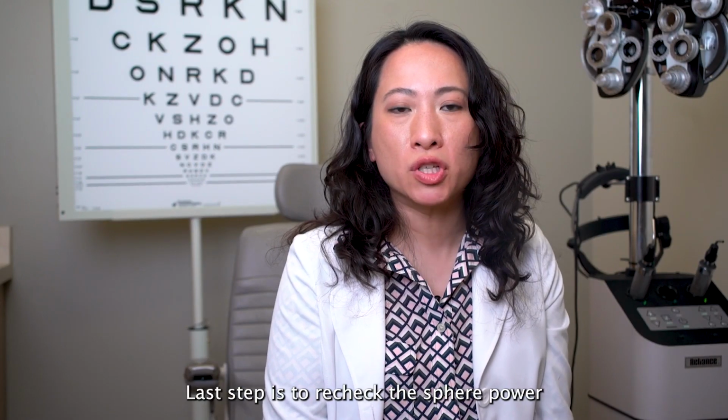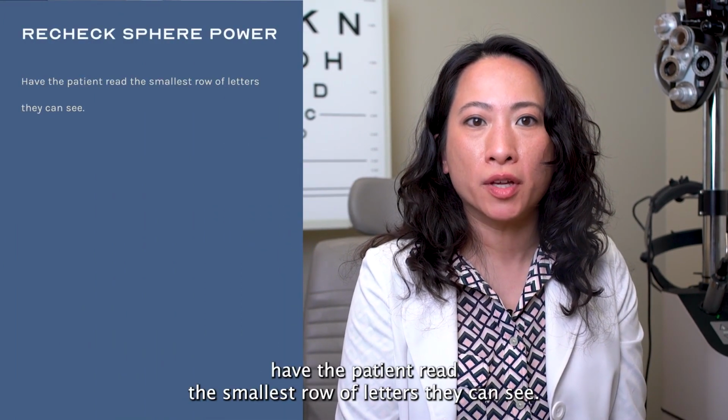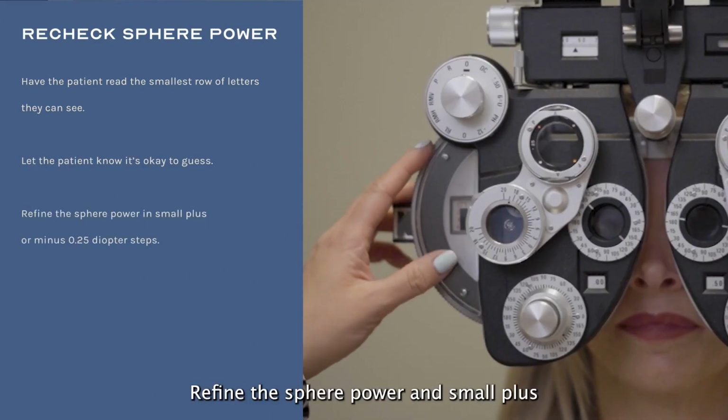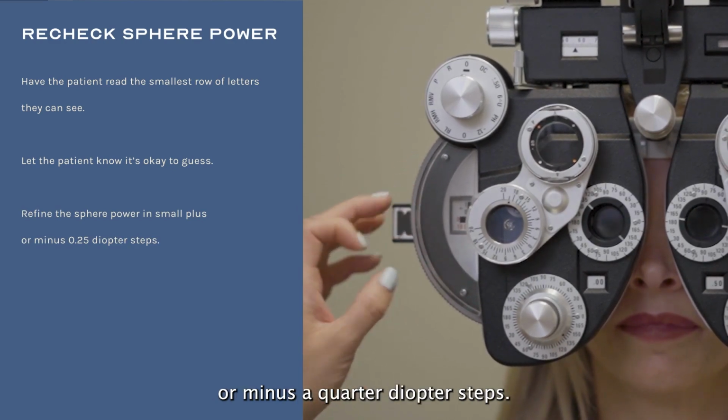The last step is to recheck the sphere power. Have the patient read the smallest row of letters they can see. Tell the patient it is okay to guess what the letters are. Refine the sphere power in small, plus or minus a quarter diopter steps.